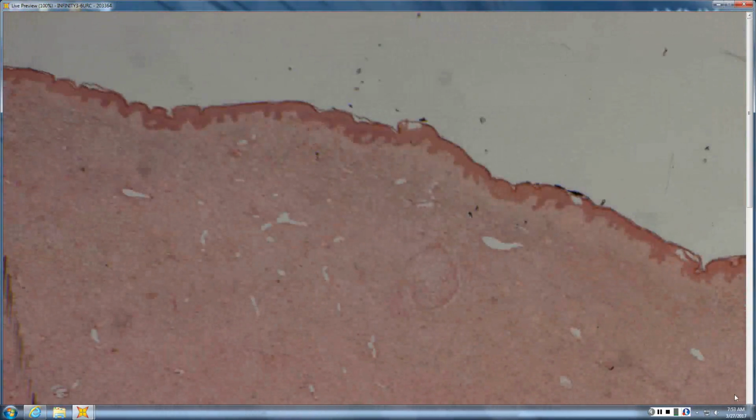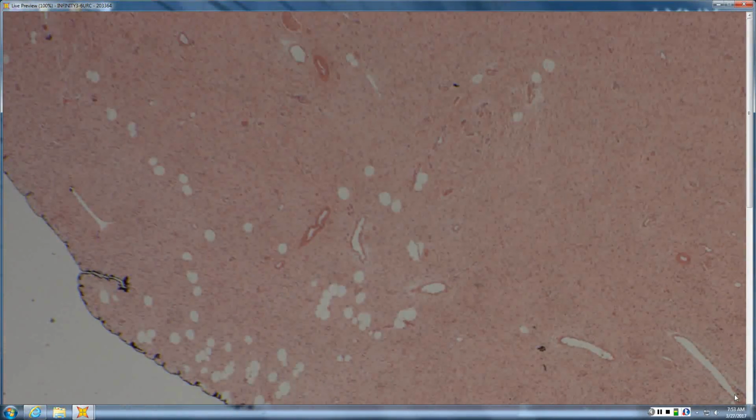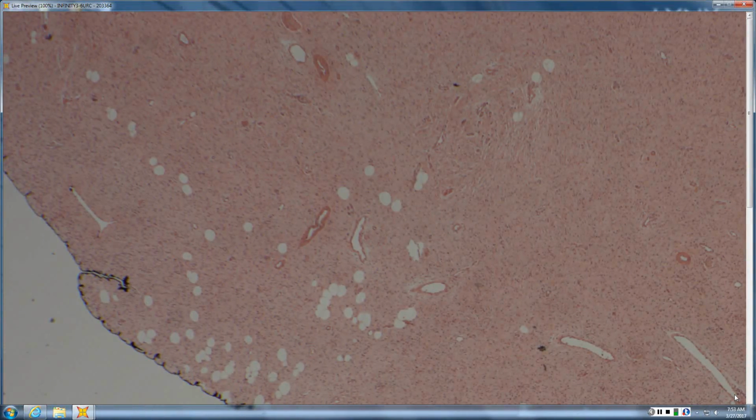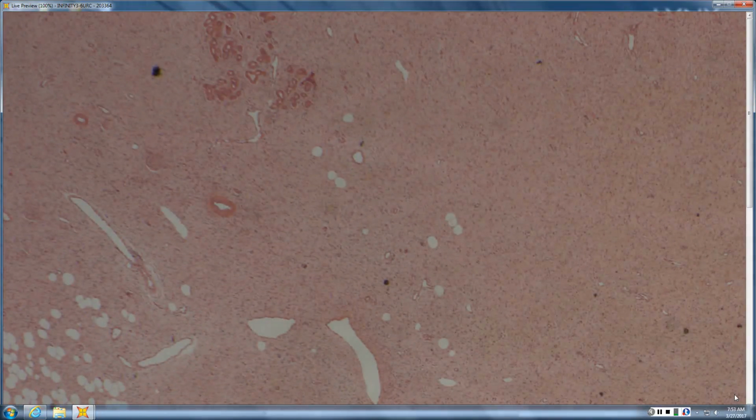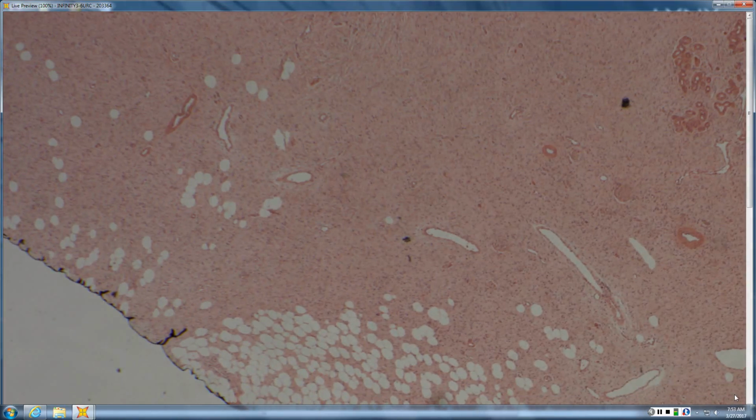This one looks like a diffuse NF versus DFSP. It looks diffuse, good for you. It looks myxoid. It infiltrates the fat in a DFSP-type growth pattern, where it's a very coarse honeycomb and then parallel strata. And you correctly pointed out that a myxoid DFSP looks just like diffuse NF on H&E. So how are you going to tell them apart? CD34 and S100.